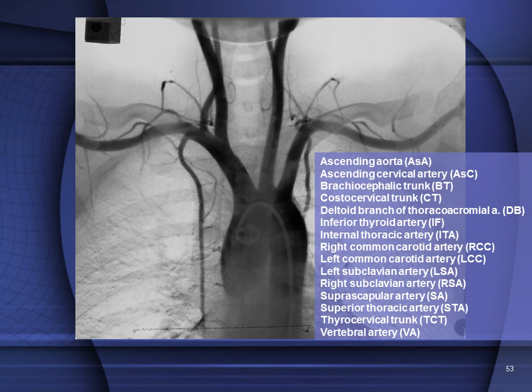And through the magic of PowerPoint, I have gone in on the film and I have labeled all the vessels for you. And we don't expect you to know all these at this time, but by the end of the course, you should be able to identify these vessels on the aortogram, aortic angiogram.